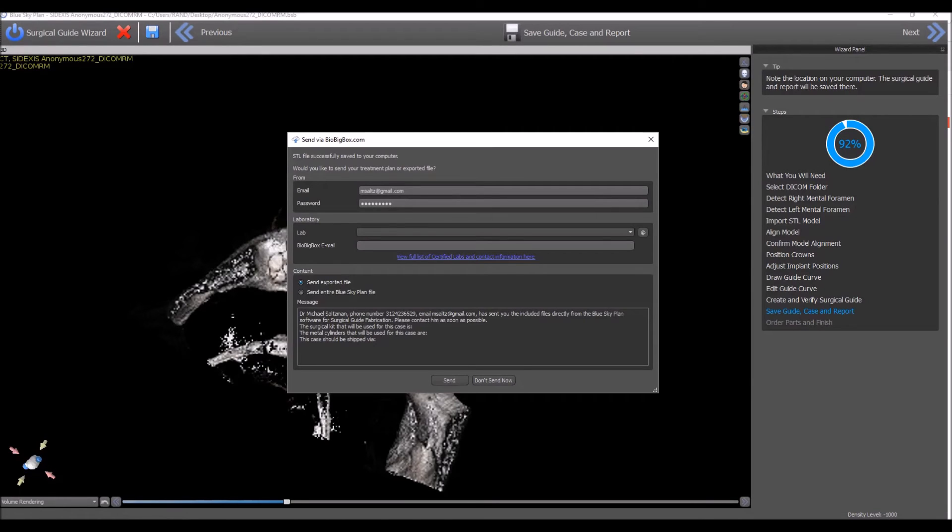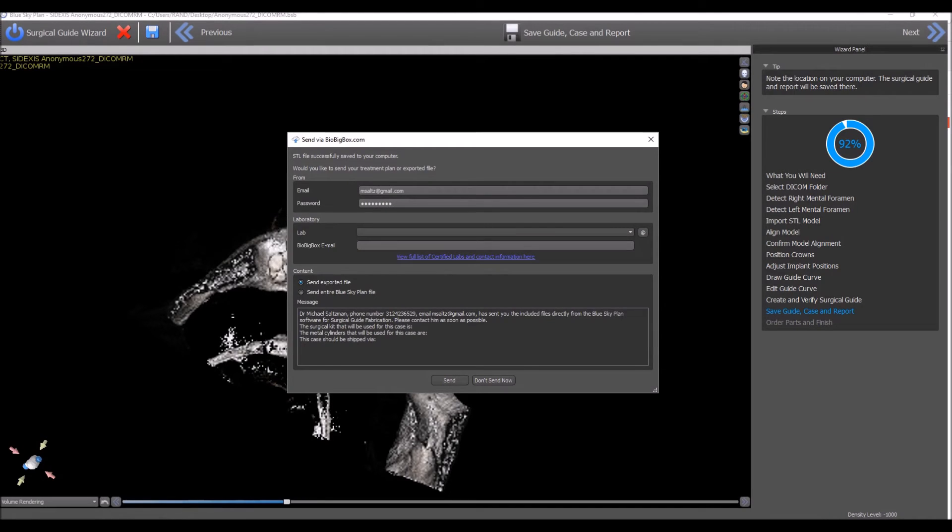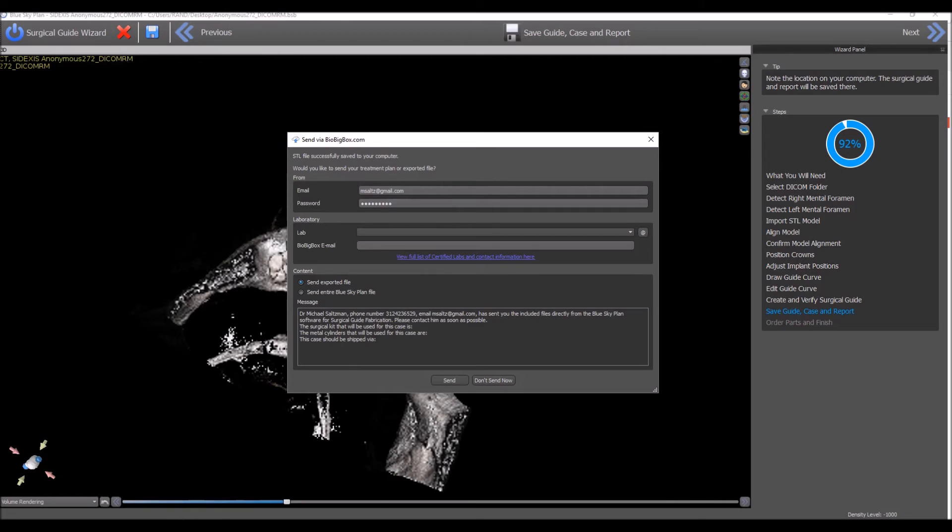The second way of sending a case from Blue Sky Plan via BioBigBox is built into the wizard. When you use the wizard to treatment plan your case and design your surgical guide, you go through the process that's outlined on the right hand side. Towards the end, you hit a stage that's called Save Guide, Case, and Report.